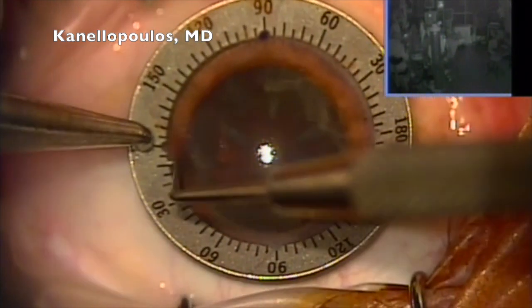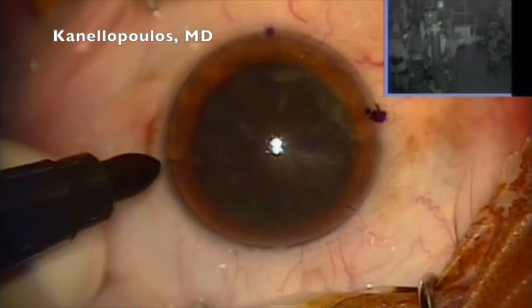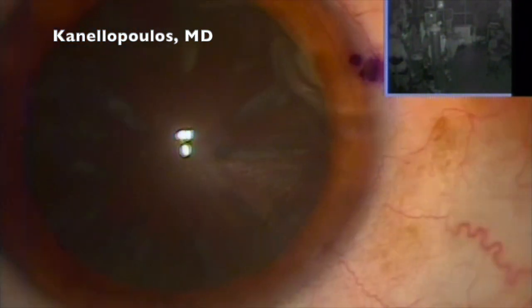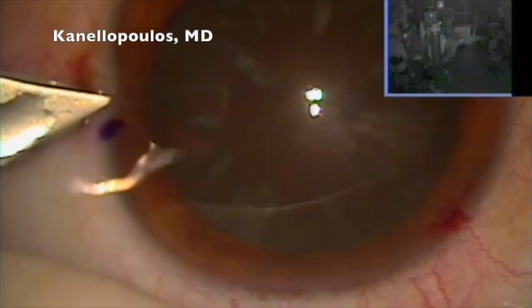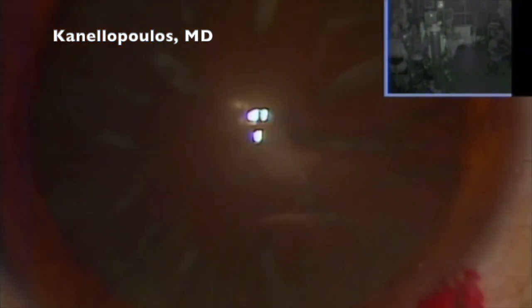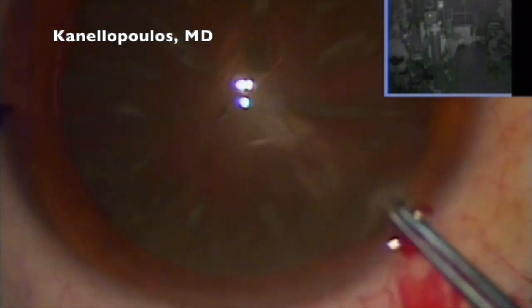This is a younger patient in his 40s. He remembers being punched in this eye. Unfortunately, what they have not told him is that he has significant angle recession. We diagnosed him yesterday. He went on directly to have the surgery. We can see the lens is quite dense. Remarkable, the other has no cataract at all. He's almost 20/200 in this eye.